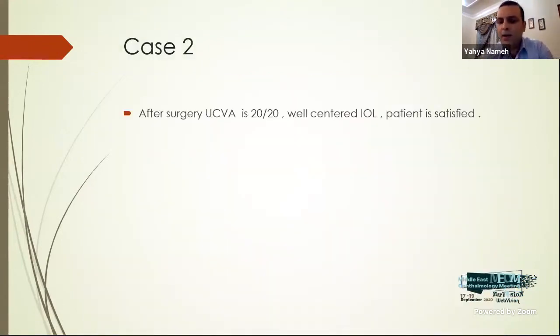Okay. After surgery, the uncorrected vision was 20/20. And the lens was well-centered in the capsular bag. The patient was quite satisfied after surgery.